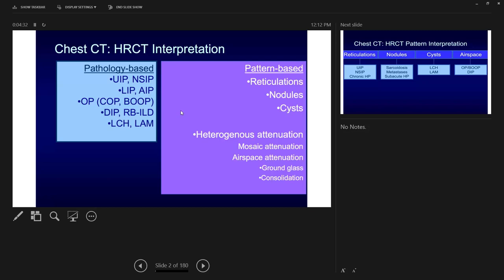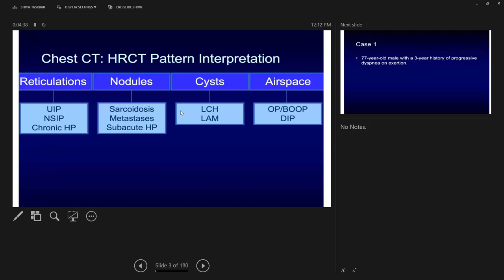The first thing to define is the major component of the CT scan abnormality: is it reticulations (linear scarring), nodules, cysts, or airspace disease (consolidation or ground glass)? Starting with reticulations, we are talking about diseases like UIP, NSIP, chronic interstitial lung disease, chronic HP, advanced sarcoidosis, or any advanced interstitial lung disease that ends in fibrosis.